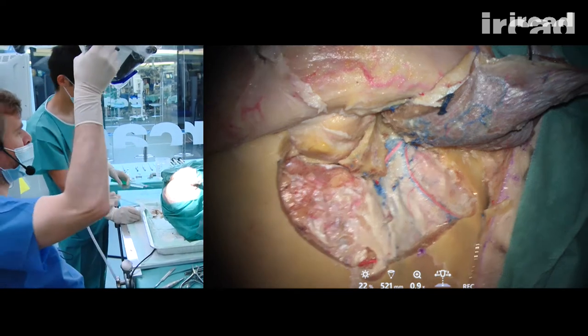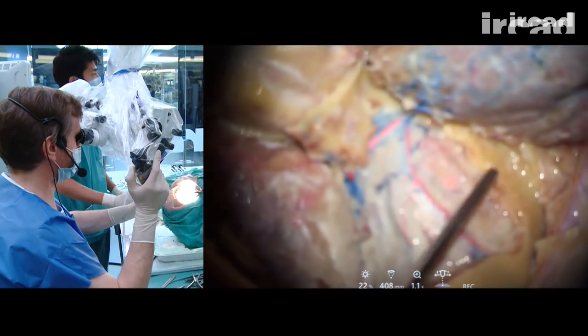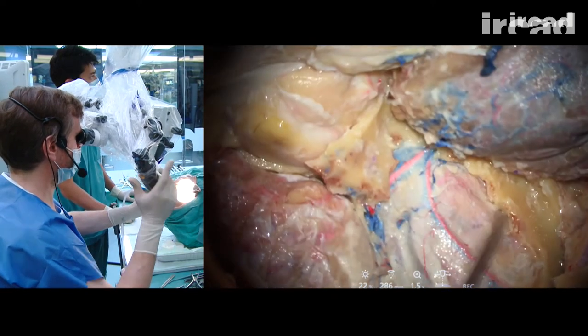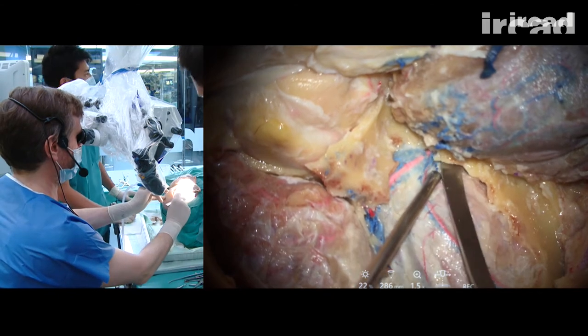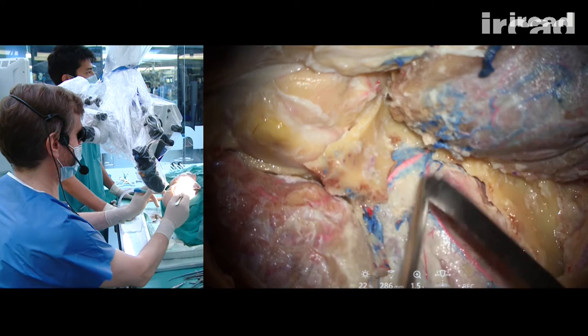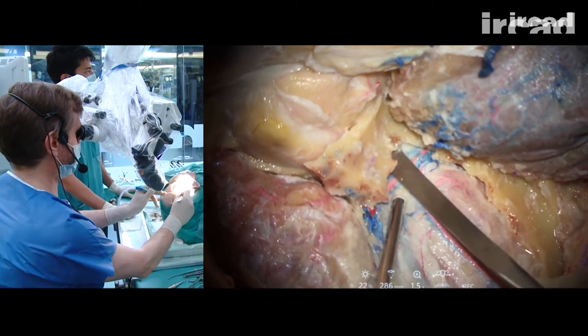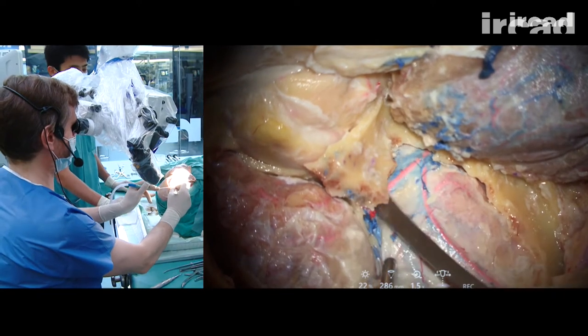We can remove this piece of bone with a rongeur and then start to drill progressively the lesser sphenoid ridge and greater sphenoid ridge to isolate the superior orbital fissure.